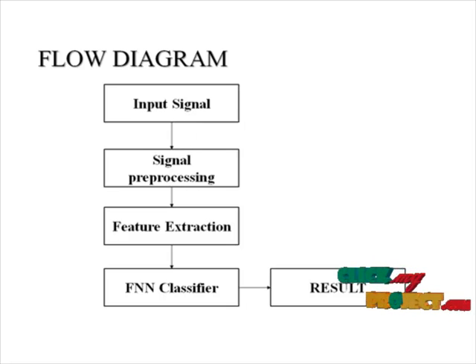In the signal preprocessing, a fast Fourier transform is an algorithm to compute the discrete Fourier transform and its inverse. Fourier analysis converts time to frequency and vice versa. An FFT rapidly computes such transformations by factorizing the DFT matrix into a product of sparse factors. There are many different FFT algorithms involving a wide range of mathematics, from simple complex number arithmetic to group theory and number theory. This article gives an overview of the available techniques and some of their general properties, while the specific algorithms are described in subsidiary articles linked below.